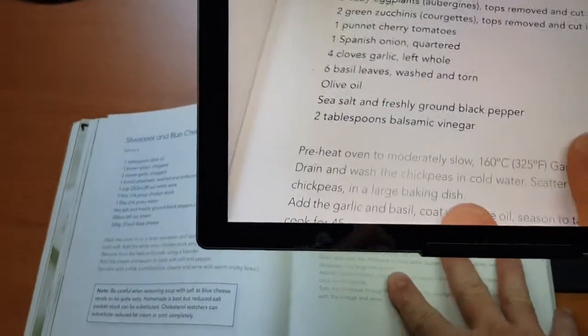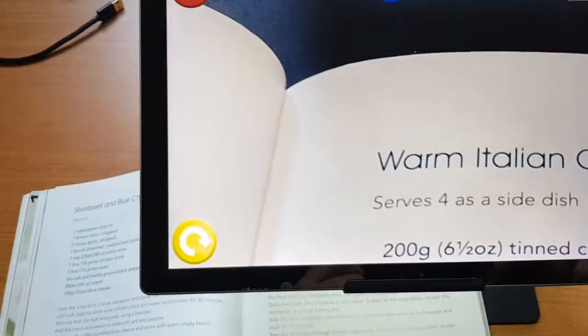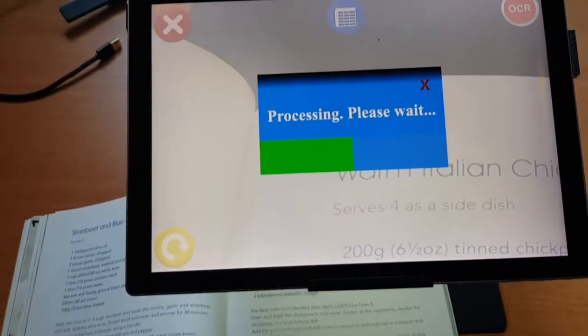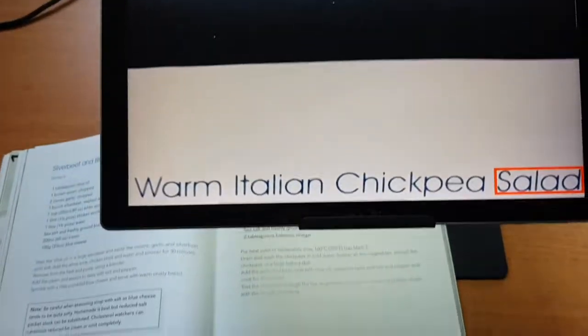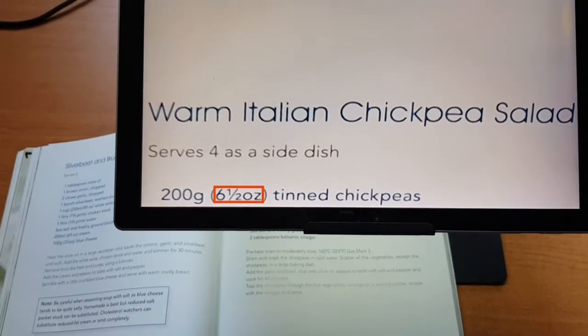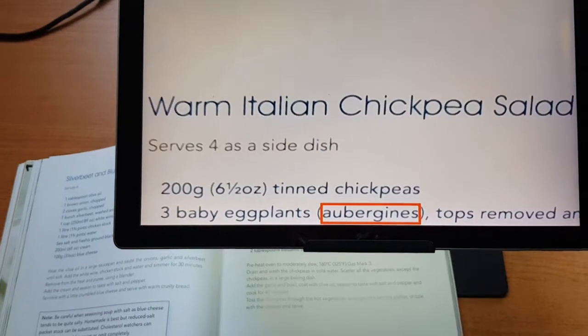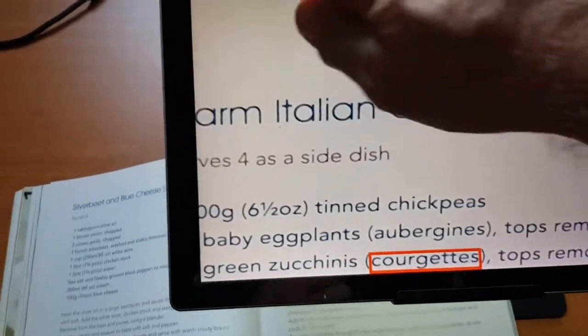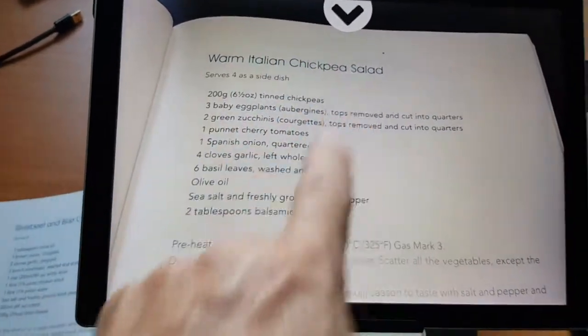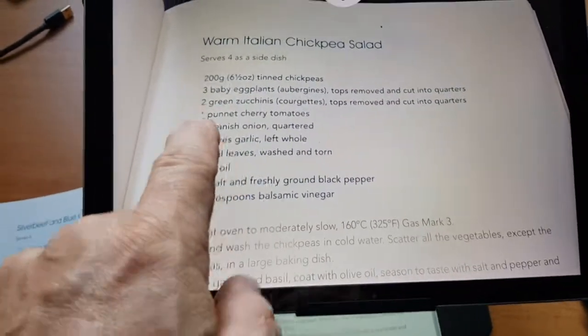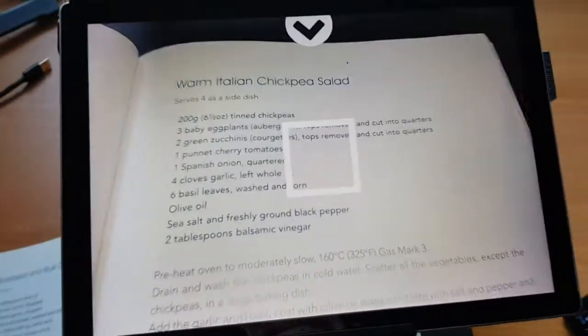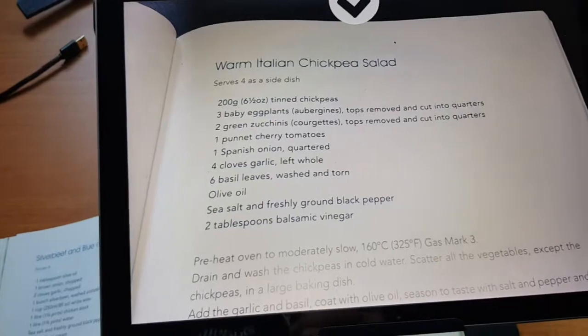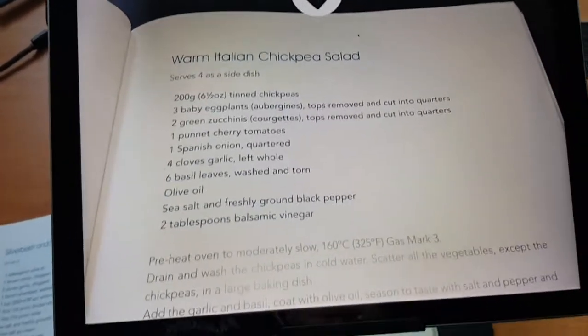Now if I do the same thing again here, we'll just take a picture, we'll do the OCR. And so this is now that would be tracking through the original, which would be very useful if you were looking at a diagram and you wanted to read from a certain point. So this is a bit similar to our ClearView Speech in the sense that you can actually direct where you want the reading to be from.